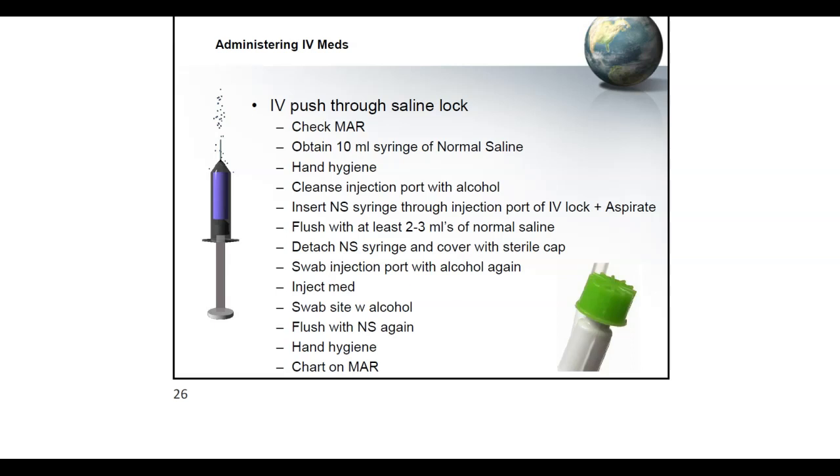And then after that, you need to disconnect your normal saline syringe, and then cap it again, cover it with a cap as you're doing everything else. So you're preparing the next thing. And then swab the injection port again with alcohol, and then give the medication.